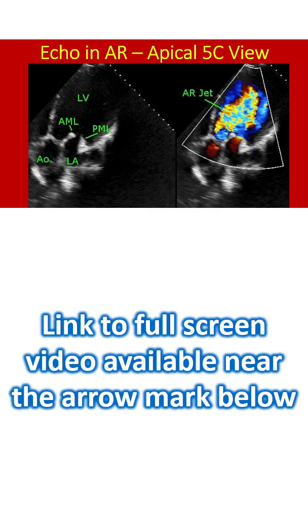Thickening of both aortic and mitral leaflets indicates the possible etiology as rheumatic. Mitral and aortic valves are the most often involved valves in rheumatic heart disease, the former being more common between the two. When there is associated mitral stenosis, the color Doppler jet of mitral flow merges with that of aortic regurgitation in the left ventricle, as both occur in diastole.